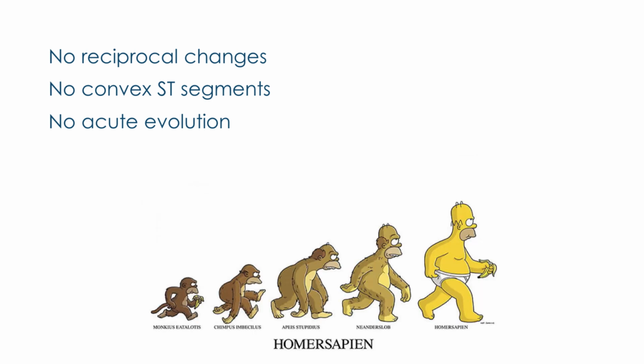And when we talk about evolution, I'm not talking about man starting off as a tadpole in a primordial pool becoming a bipedal organism. I'm actually talking about how EKGs tend to change over time. If you have a patient that you're really concerned about, get more than one EKG. If those EKGs change over time, that should be a concerning feature.